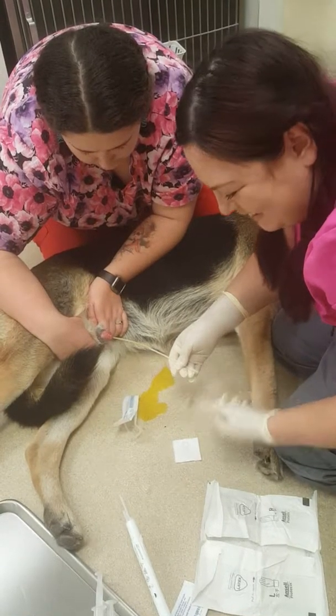That's probably about good right there. I'm going to grab my sterile syringe and pull up the sample. You always want to get rid of the first few mLs because they're not worth anything — then pull back for a sterile sample. Obviously Moomer's bladder does not have that much urine, so we're going to go ahead and stop and pull out our urinary catheter.